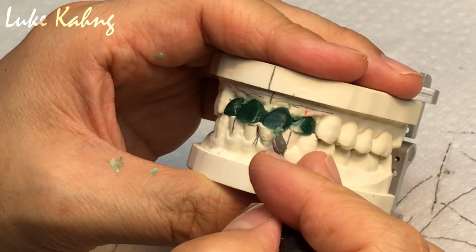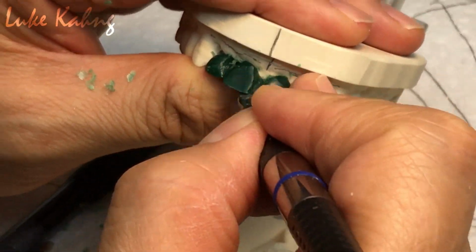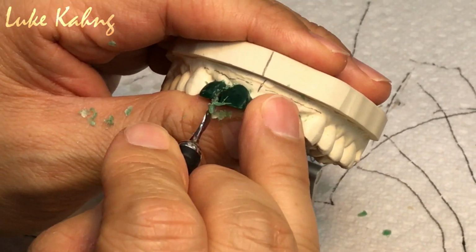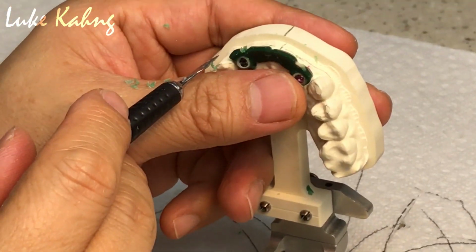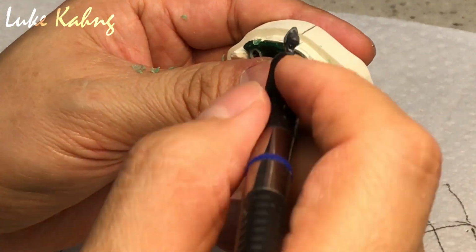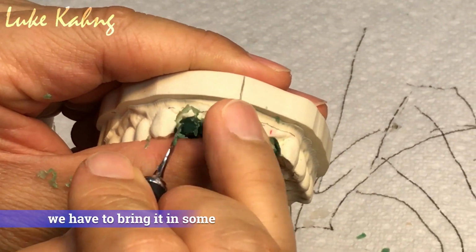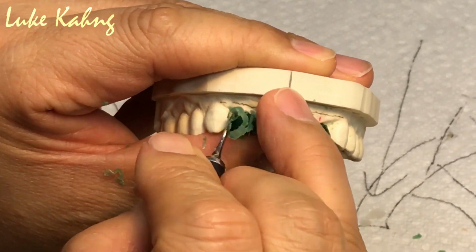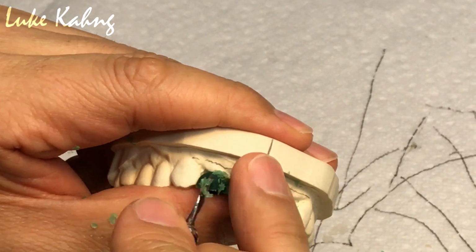See? Longer than this, now we cut it. Like that. Wider than this, now we cut it. Same thing, domino effect. Whenever we make, duplicate it. Duplicate it. Now it's too thick, right? Yeah. Way thick compared to this, right? Yeah. We have to bring it in. Like this, because we have plenty of room. See, plenty of room, fascia.